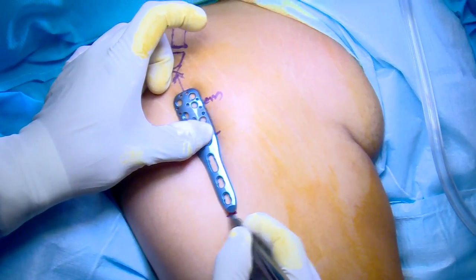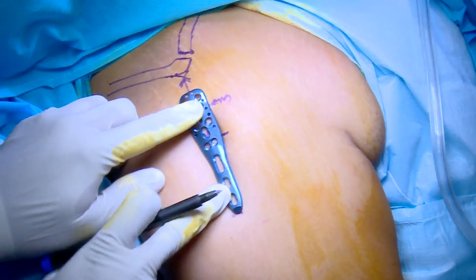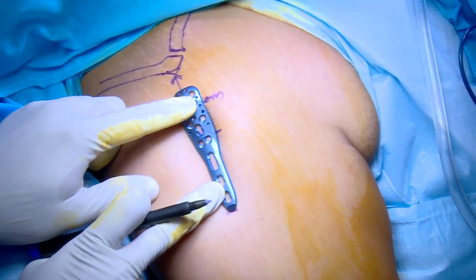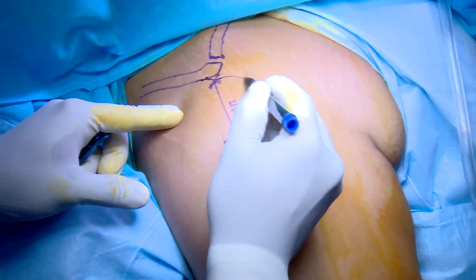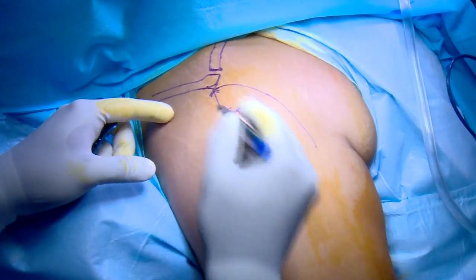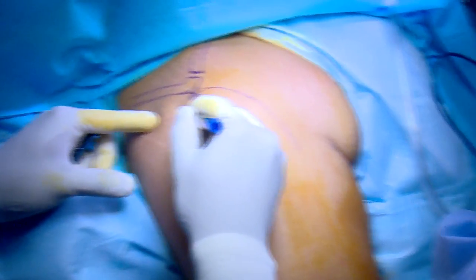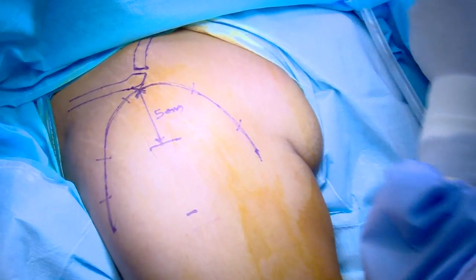The inverted U incision is marked on the skin with the summit at the tip of the acromion. The course of the axillary nerve from the tip of the acromion is around 4 to 6 cm. The limbs of the U should be of adequate length to allow the use of a 3-holed PHILOS plate, and further screws into the distal segment can be inserted through stab incisions.